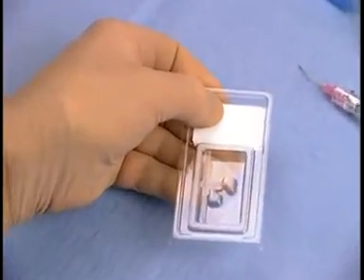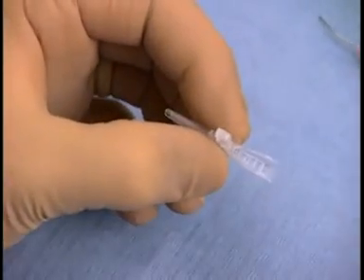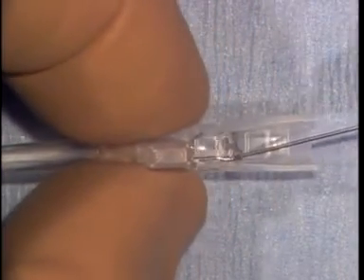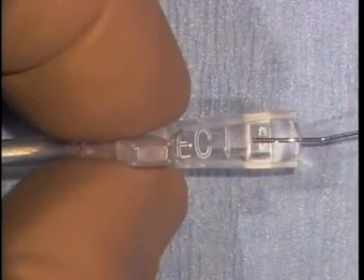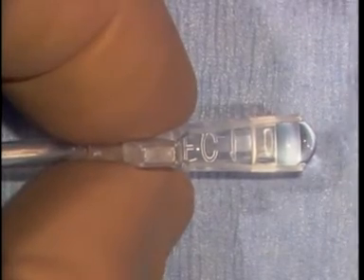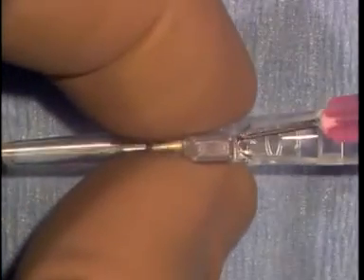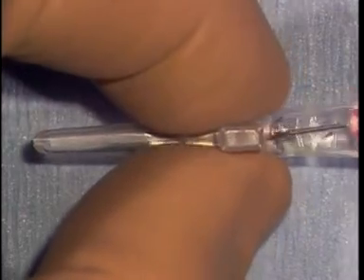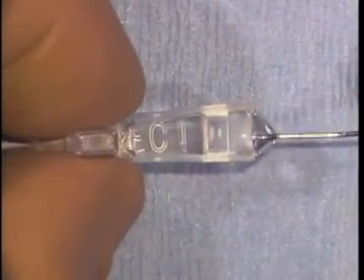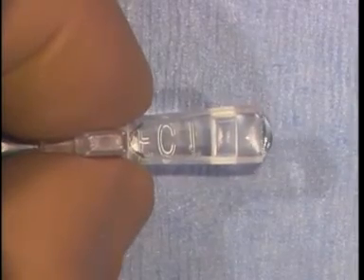Next, remove the injector cartridge from the package and hold it between the thumb and forefinger at the central area near the locking tab. Fill the injector cartridge with BSS. Partially fill the cartridge with a methylcellulose-type viscoelastic, creating a trail out of the cartridge bay. This combination will minimize friction between the ICL and the cartridge walls.